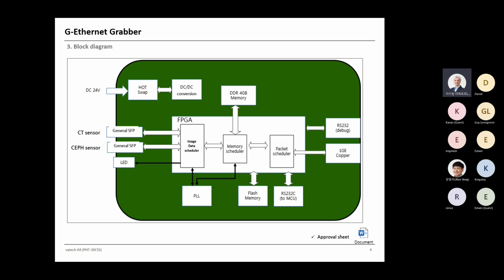Why? Because by changing the transmission method to network communication, we have the following advantages. Why we changed it to Ethernet type connection? Because now it's independent from PC and OS, all right? And the PCI-based grabber had been recognized for problems on some PCs.